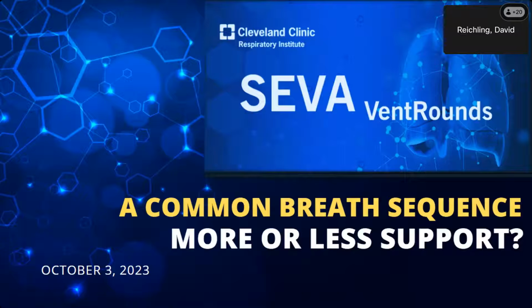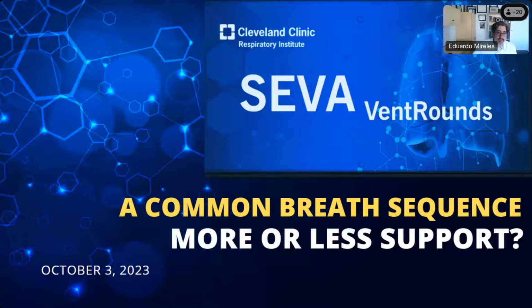Good afternoon, everybody. Welcome to SEVA VentRounds. Today's October 3rd, 2023, and we're going to see a common breath sequence. And the question is more or less support.